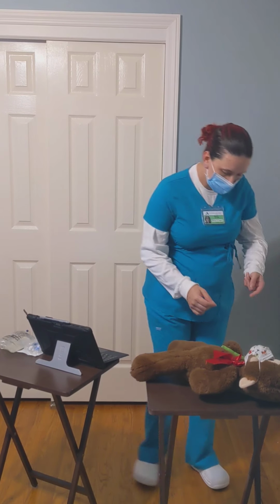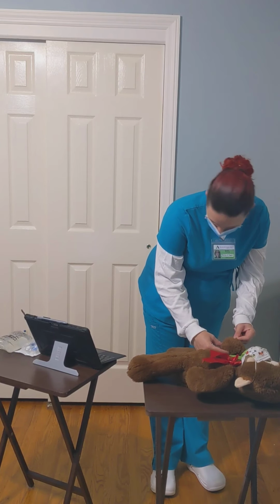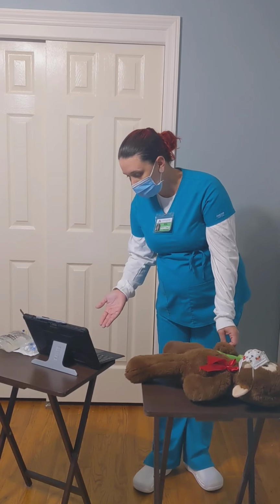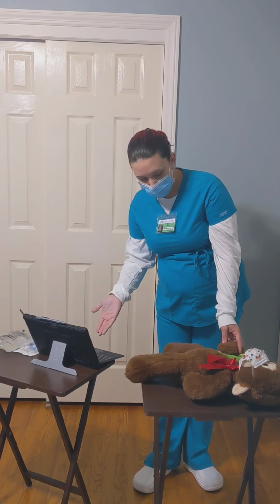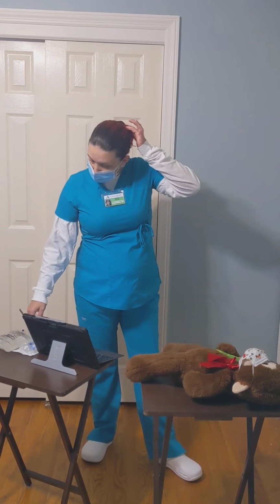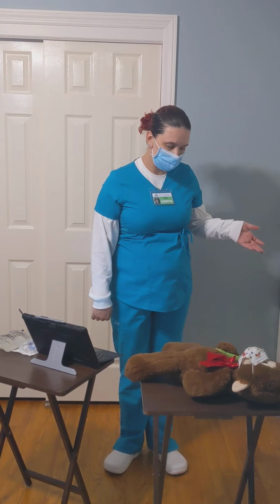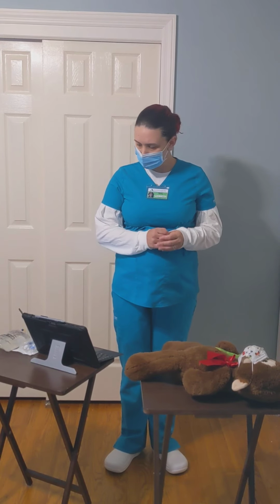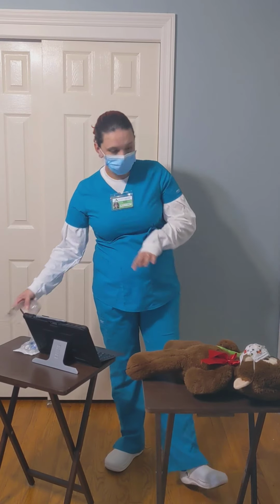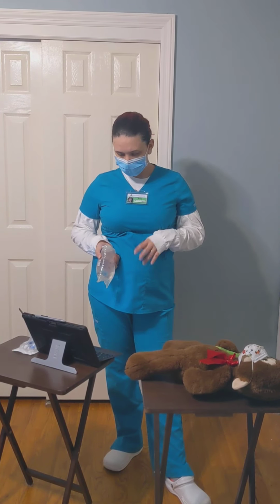I'm going to take a look at your armband. Can you please tell me your name and date of birth? So I'm going to compare her name and date of birth with the patient's record that I have open and the MAR. This is the correct patient. So Mrs. Nagel, you have some complaints where they're concerned you have some signs and symptoms of an infection after your surgery. So we're going to administer Zosyn, which is an antibiotic that can treat a lot of different types of bacteria, so we can get you feeling better.